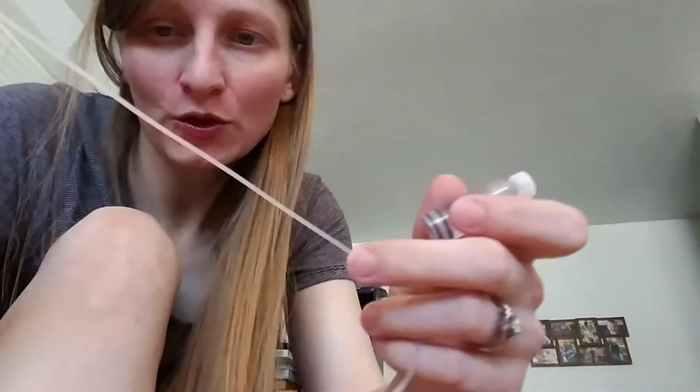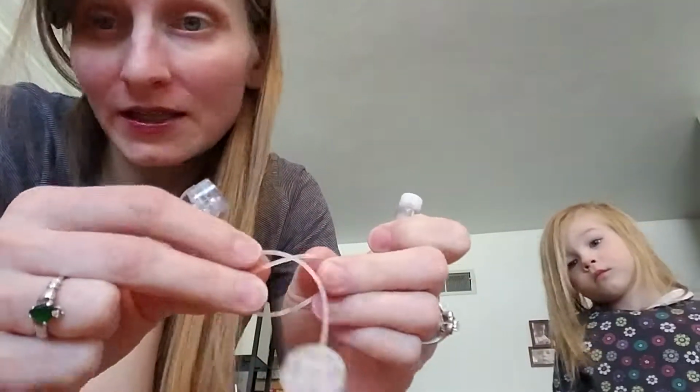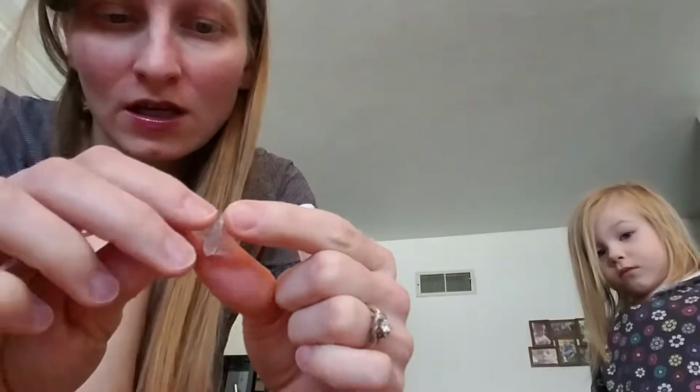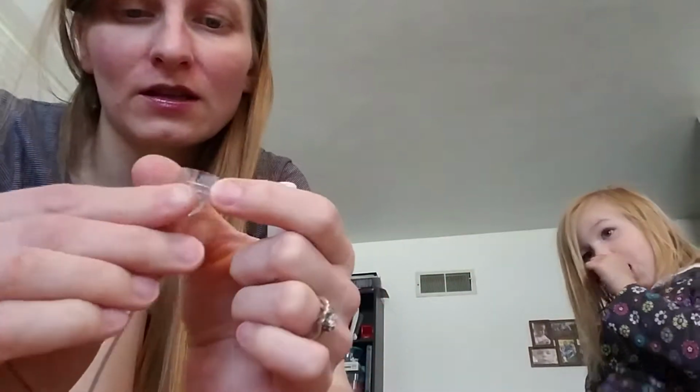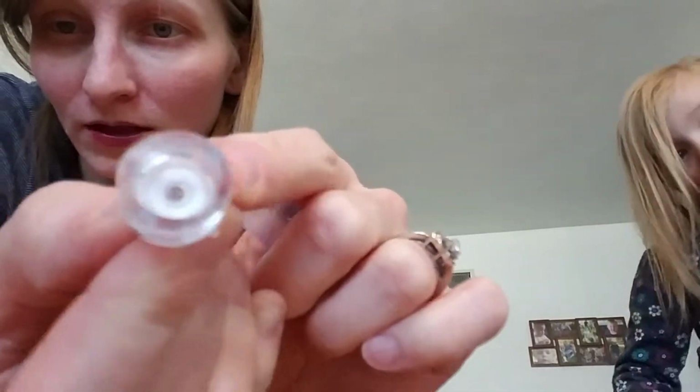Then I have my tubing here. I like getting the longer tubing because that means if it falls off my pocket, it touches the ground and it doesn't pull it out of my skin. So that's one reason I like it. There's a little needle in there.